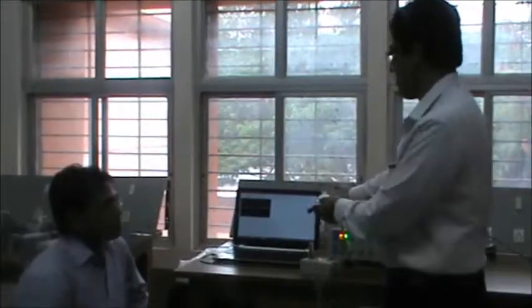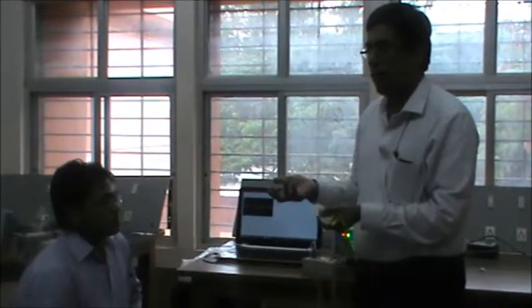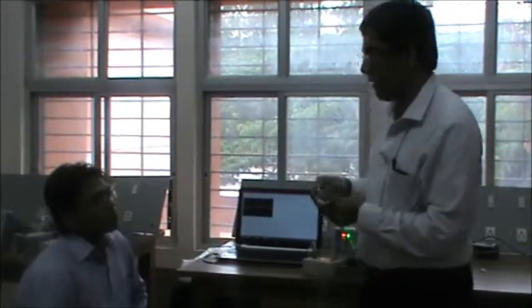Now we will look into this. This can be imported into MATLAB or LabVIEW or Excel and taken for further analysis.